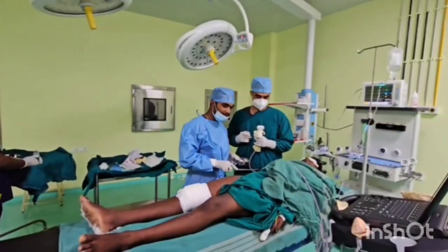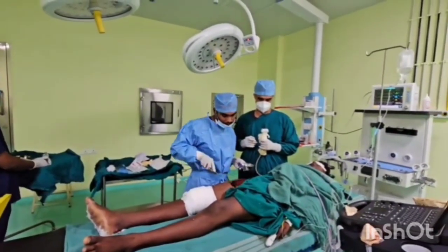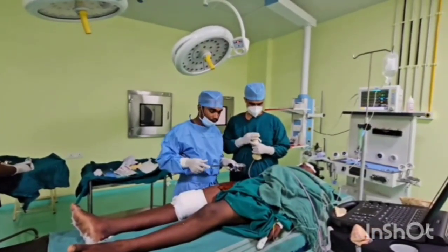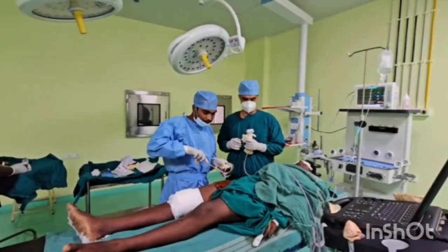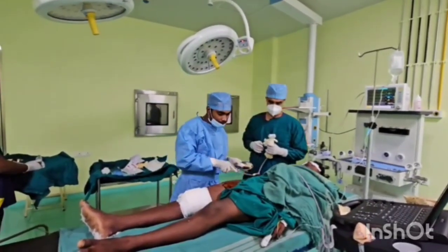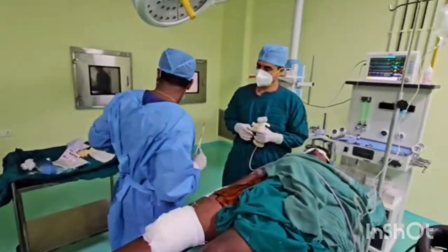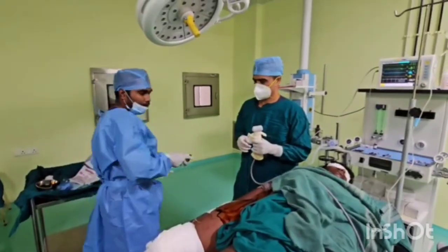Here is a 40 years old male patient who has sustained injury to the hip leading to IT fracture caused by RTA, and now he has been posted for elective hip surgery. The patient has undergone IT fixation under spinal anesthesia with proximal femoral nailing.